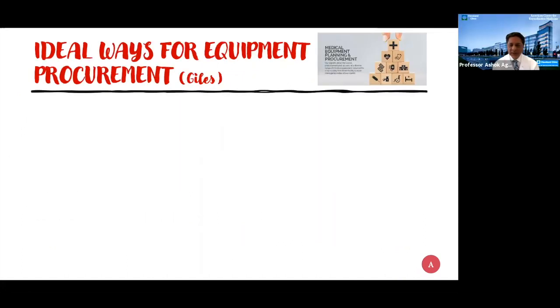Thank you very much, Alex, for your comments. So what we understand is that turnkey is like a complete package deal that you are ordering. You are pretty much getting the full meal and you don't have to do any legwork. Everything is done for you by whoever is the company in the business of doing the turnkey. You don't have the choice to select the various things that you want. So for those who are very picky customers, probably turnkey may not be suitable.